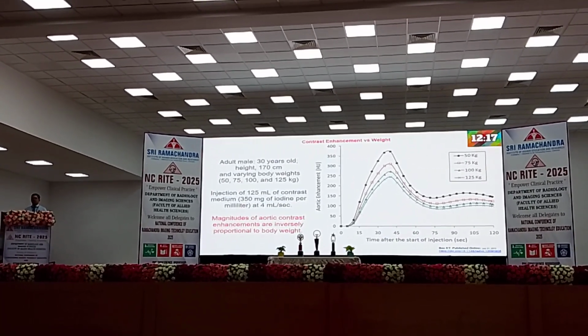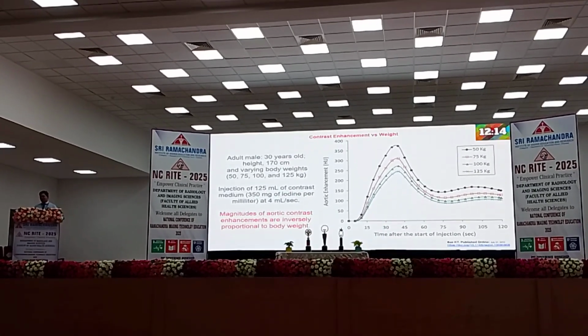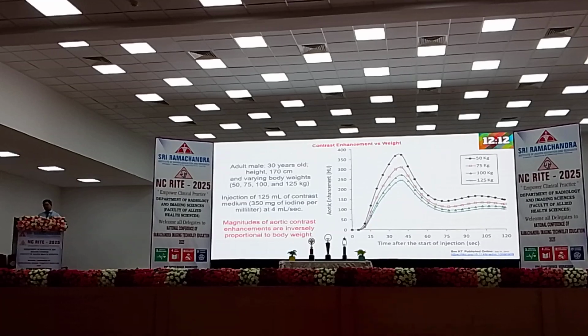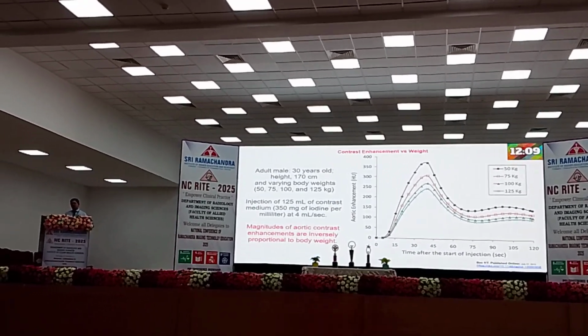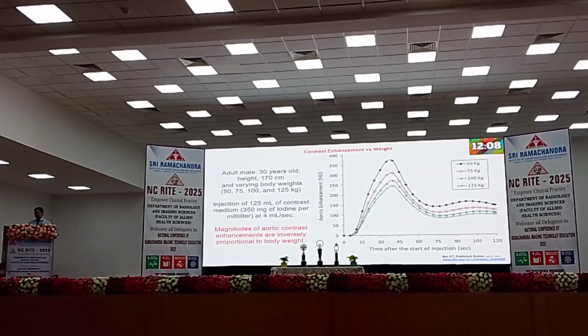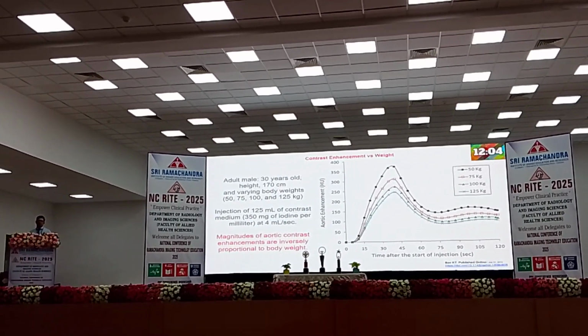Whenever you are doing any angio or any procedure, is 300 to 400 Hounsfield unit required to do the angiogram? Not required. If you have between 250 and 300, it is more than enough.